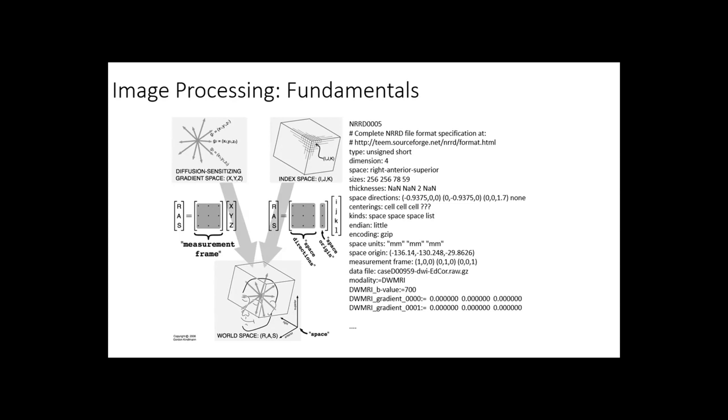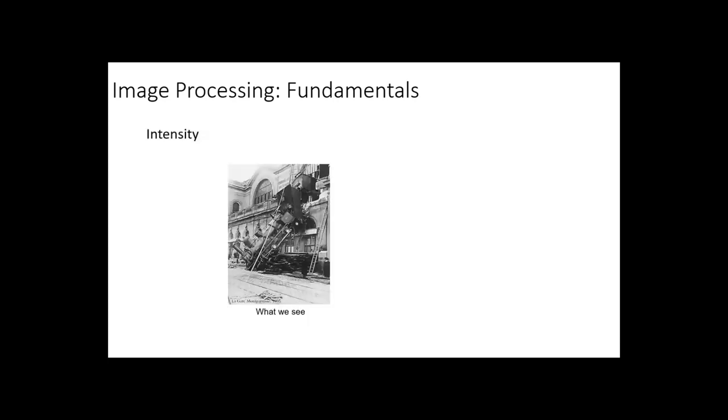This is what we call image segmentation. Different people have different brains, and the size is different, right? Like your hand: someone's hand is big, someone's hand is small, but we all have 5 fingers. So we have to align that shape. This is what we call image registration. Go to the next slide. So we need a lot of image processing algorithms to process the image.